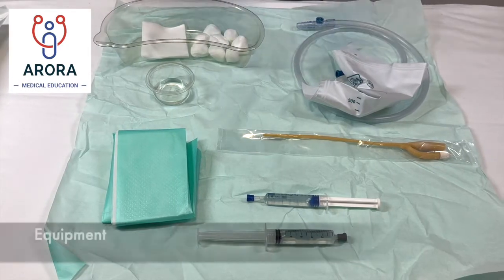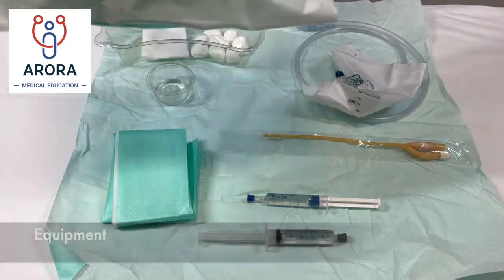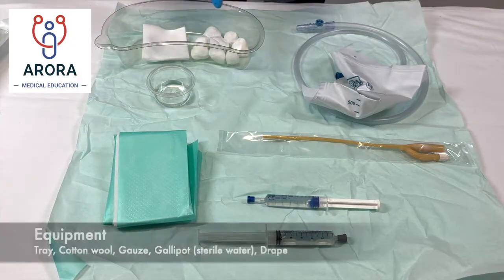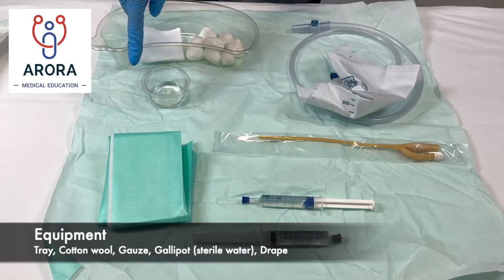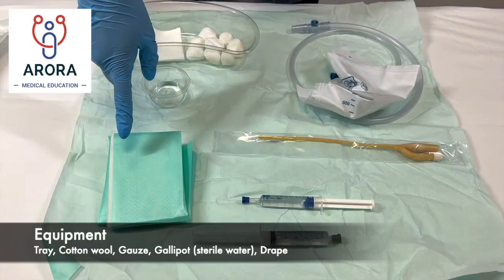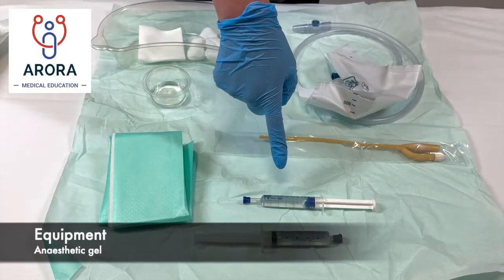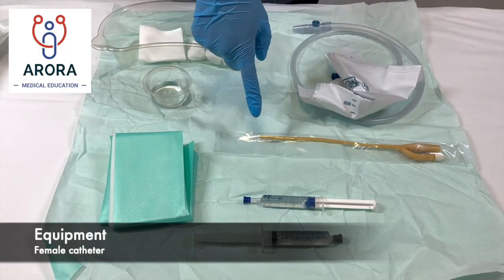For female catheterization we need to start off with a sterile field. Most of the equipment we need will be in a catheter pack — in here we have a tray to collect the urine, some cotton wool, some gauze, a galley pot with some sterile water, and a drape for the patient. We'll also need some water to inflate the balloon, some anesthetic lubricant gel, and a female catheter — checking it's the right size and in date.